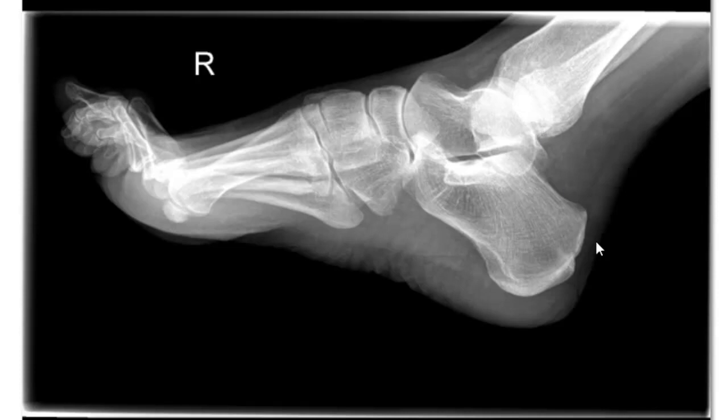Going over the anatomy, all the toes should be superimposed. Most of the metatarsals should be one through four, but the fifth metatarsal base should project inferiorly to the rest of them. I see a sesamoid or two here — it looks like there might be multiple superimposed. You have the cuneiform superimposed along with the cuboid, which should be a little more free of superimposition superiorly. The navicular looks good, and the calcaneus looks good. I always look for the sinus tarsi — this looks okay.